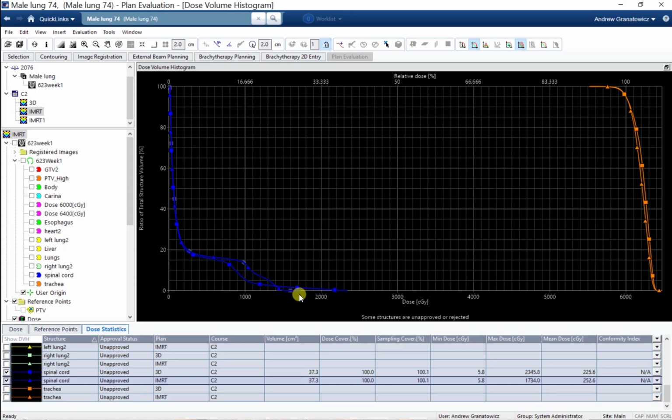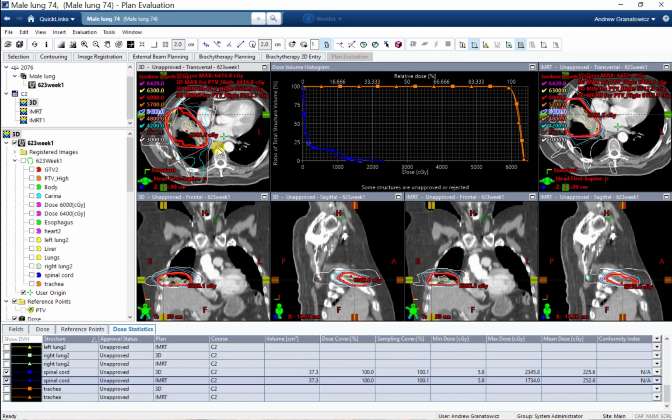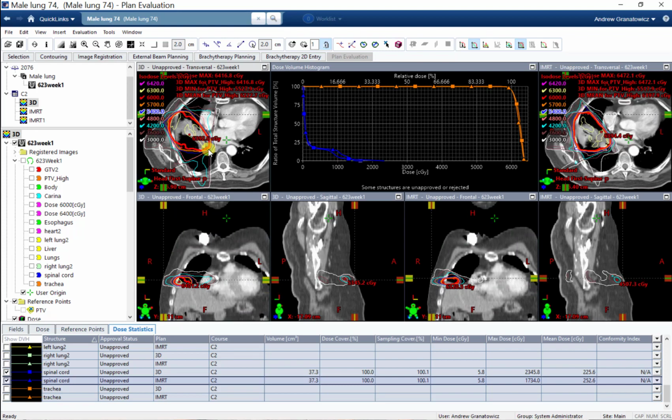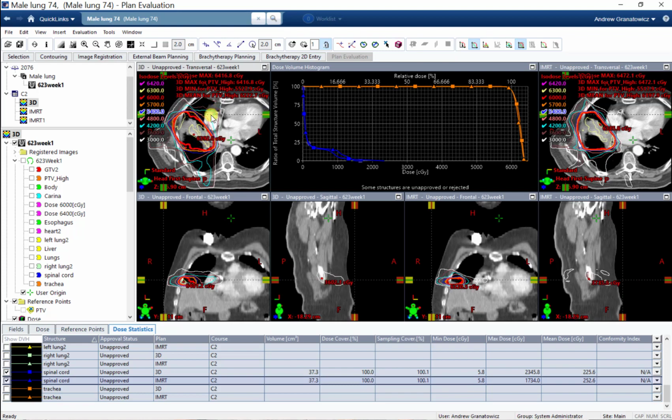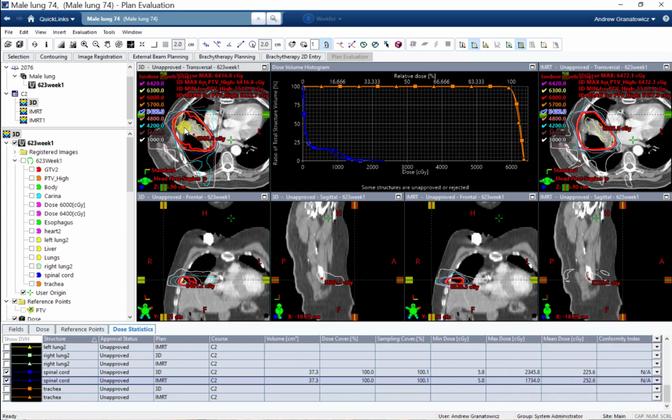So what I wanted to get across, hopefully to you guys right away, is that with VMAT, IMRT, things like that, you can do some very cool things, and definitely a lot of times VMAT or IMRT is necessary to do those things. Again, just from the basic fact of what we talked about, right? An optimizer can do a lot more complicated MLC shapes than we practically could ever do with 3D. And for complicated PTV shapes, especially if the PTV concaves in, imagine a kidney bean shape, it has that concave in. You cannot get your dose to conform to a shape like that with 3D. But with IMRT and VMAT, you definitely can, right?